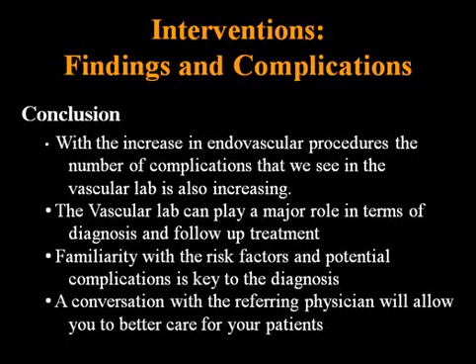So in conclusion, with the increase in endovascular procedures, the number of complications that we see in the vascular lab is also increasing. I believe that the vascular lab can play a significant and major role in terms of diagnosis of these lesions as well as in follow-up and treatment. I believe that familiarity with the risk factors and the potential complications is key to the diagnosis, and always a conversation with the referring physician will allow you to better care for your patients.